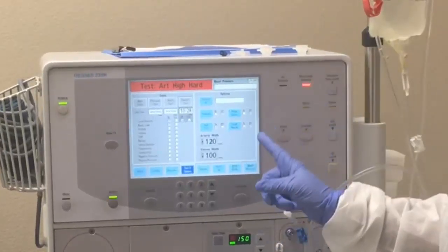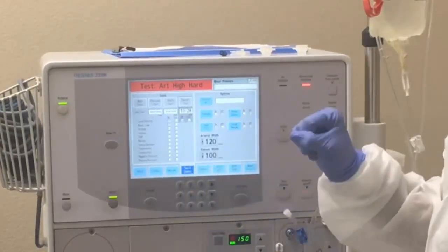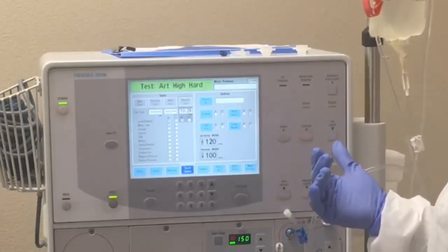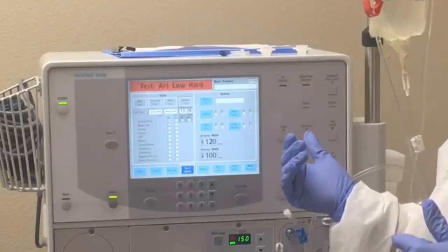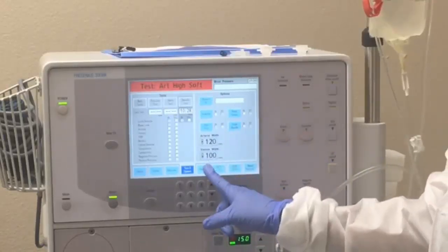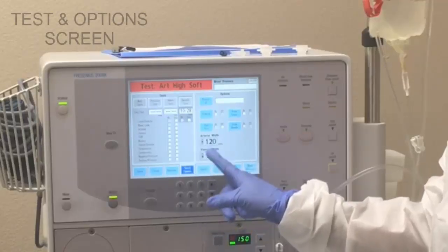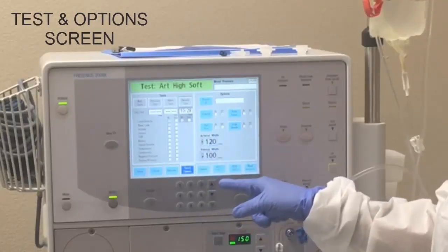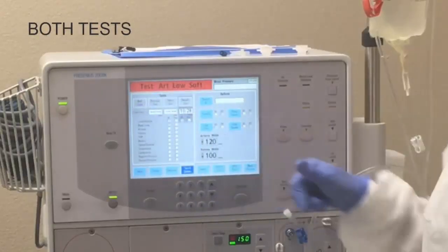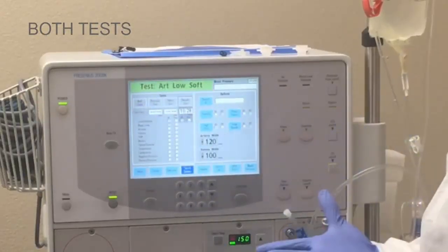So here we are in the fourth screen and this is alarm testing. All you need to do — the machine has started to do alarm testing already — but all you need to do is go to the test and options screen, and you could click both tests and confirm and the machine will start doing the test.